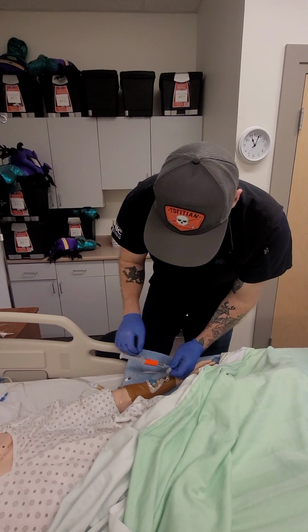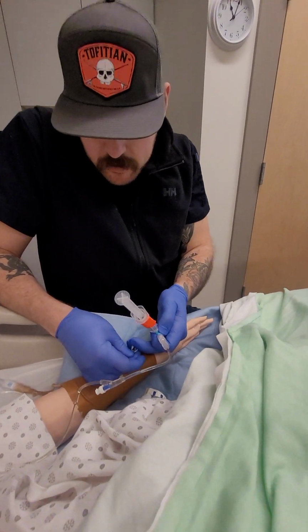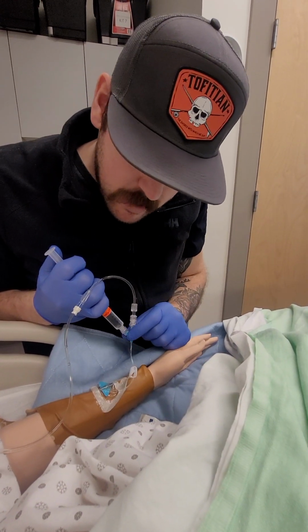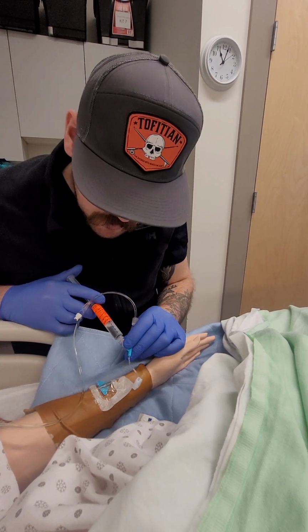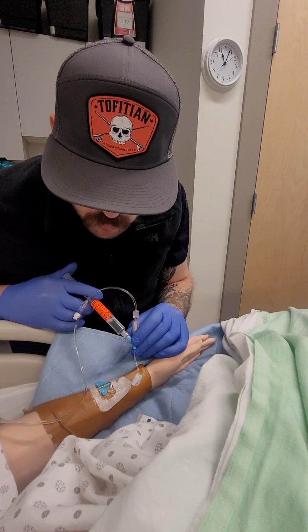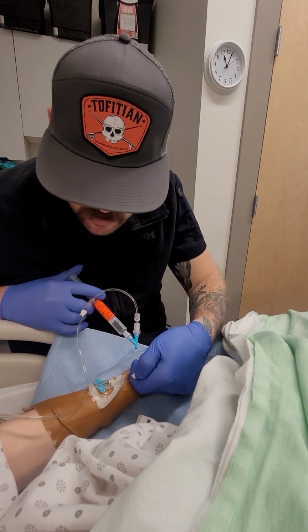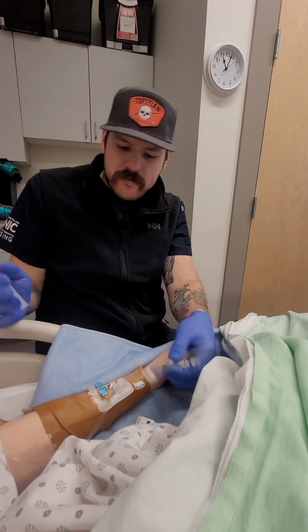So what I'm going to be looking for here, I'm going to take this clamp off here, and I'm just going to aspirate, and I do see blood back in the line. So then we're going to just give a little bit of fluid, 1 mil push, perfect, 1 mil push. And then on our last one, we want to leave this line with positive pressure. So we're going to do about 4 mils and clamp before we stop. Perfect. So we've ensured patency here.